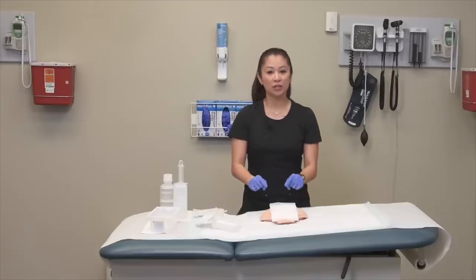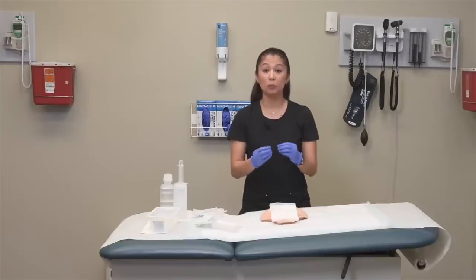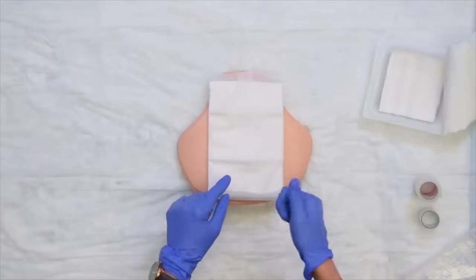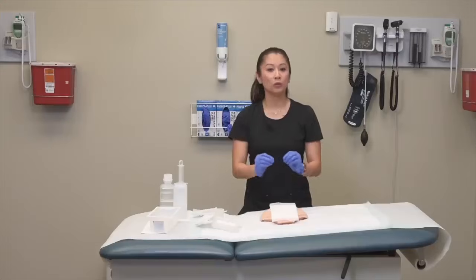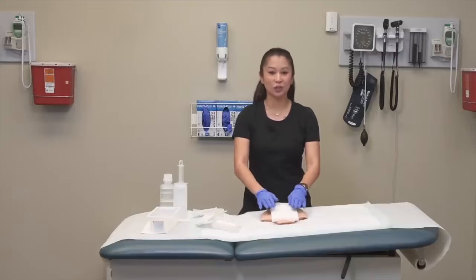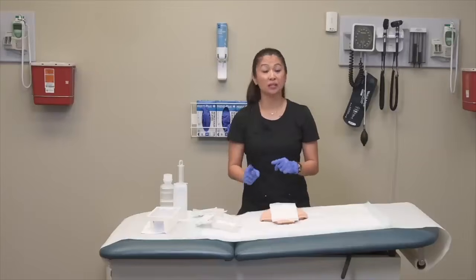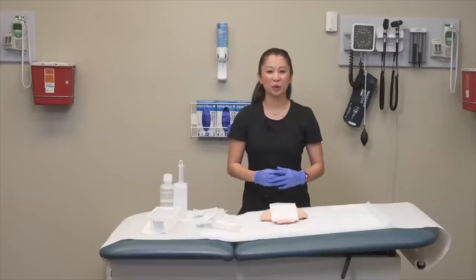One thing I want you to talk about: we love these ABD pads as nurses because they're a little bit more absorbent, and the blue line goes to the sky. The more absorbent piece is on the wound, so just keep that in mind with these. These are called ABD pads, and in fact, we do use these a lot for abdominal wounds because they're much bigger and they're absorbent.